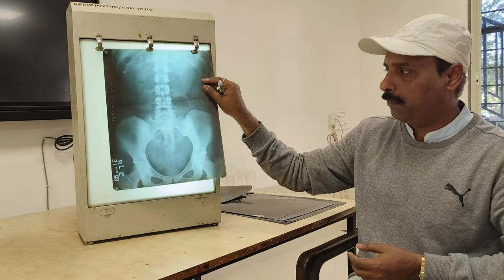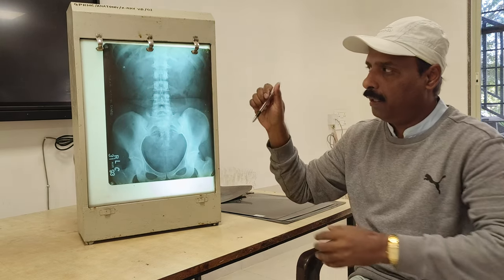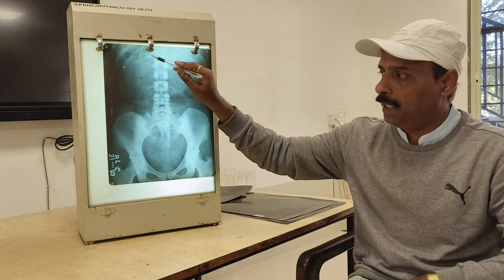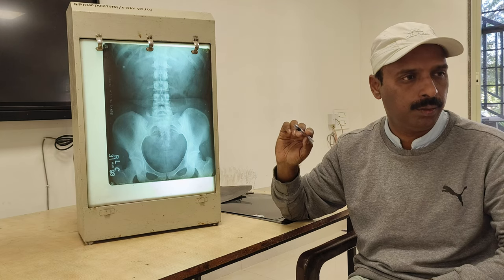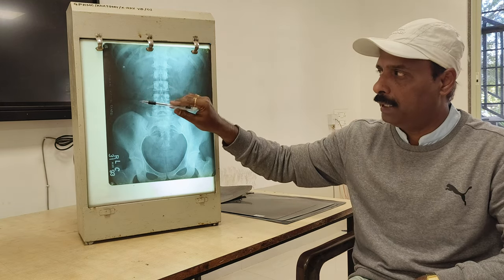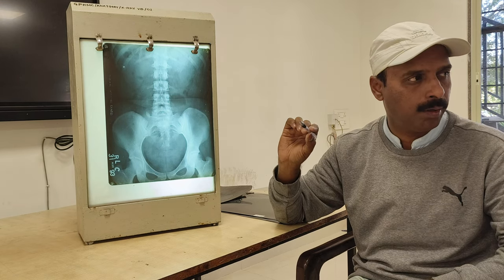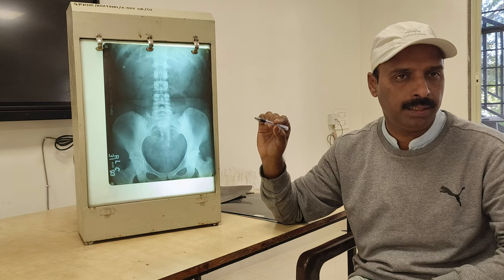Then next, you have to know the other part, other contrast x-ray, or this is the one which is a plain x-ray. This is a plain x-ray of the abdomen, we call it the x-ray of KUB. Plain x-ray, in which you can see all the KUB: kidney, ureter, urinary bladder, to visualize the kidney, ureter and urinary bladder.